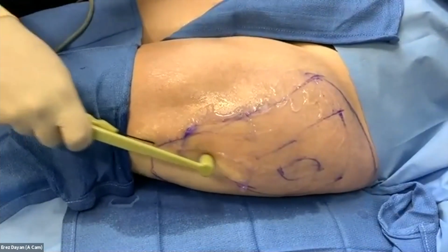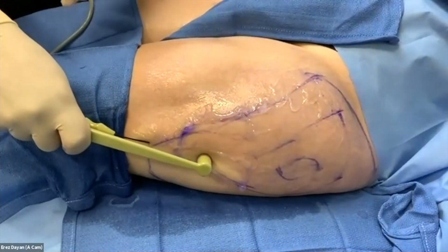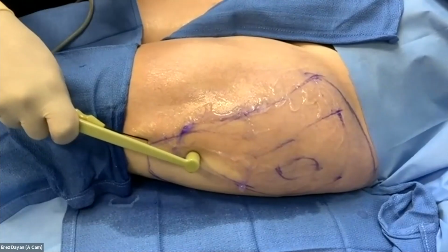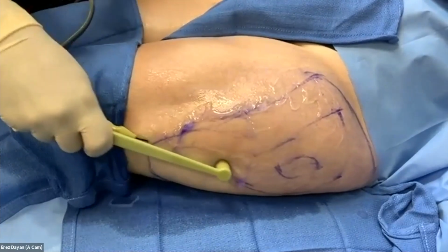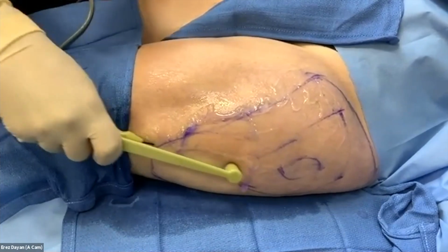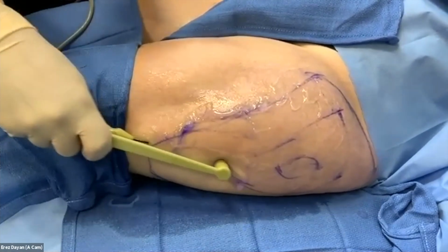Once you reach the target temperature, how do you know how much longer to do it? It's a little bit arbitrary, but I would say normally I stay on for about 45 to 60 seconds, and that's kind of worked. I think if you hit target temperature and come right off, it's kind of underdoing it a little bit. So I think you do need to stay on for a period of time.